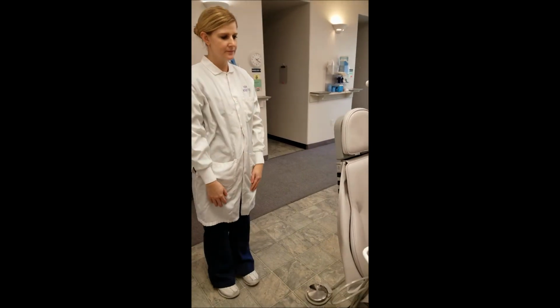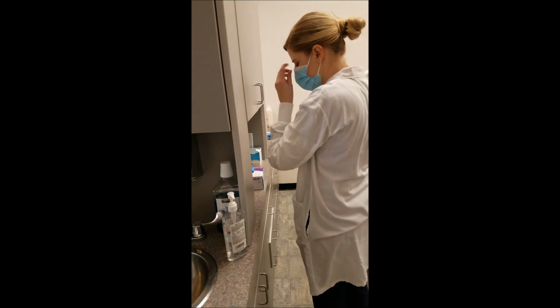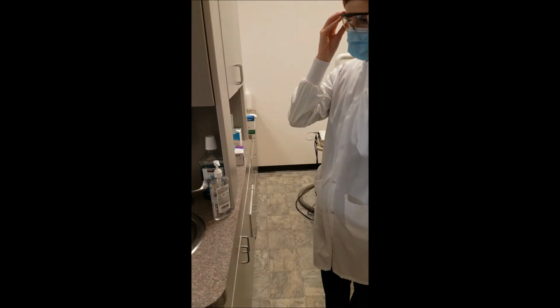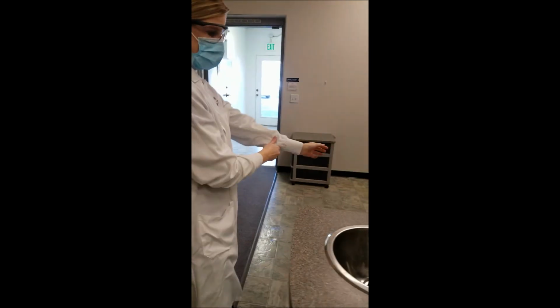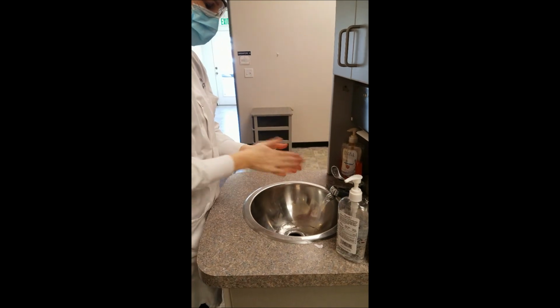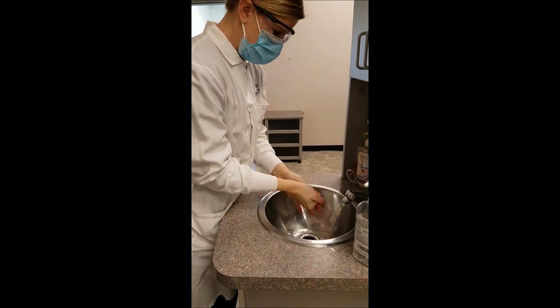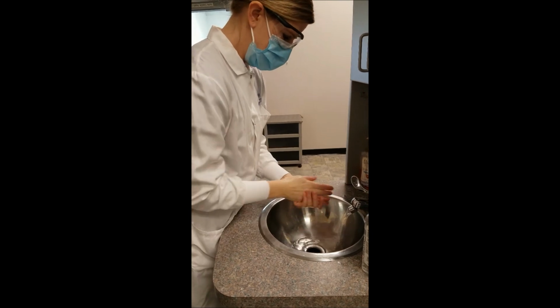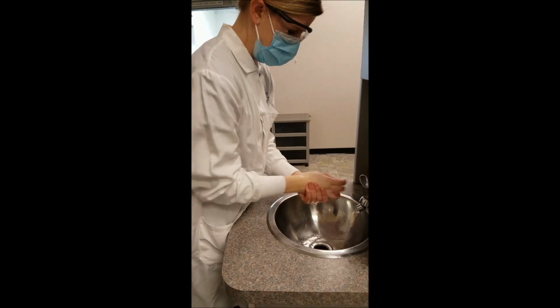Then she will put on mask and glasses. And then she will wash her hands using the aseptic technique. We will do this 3 times for 30 seconds each. For this video, we will just be doing one 30-second hand wash for you to see.